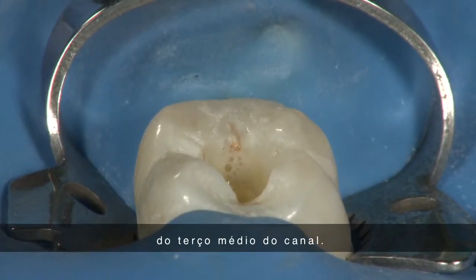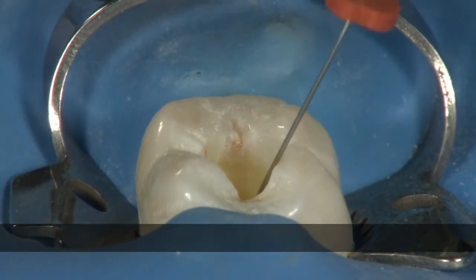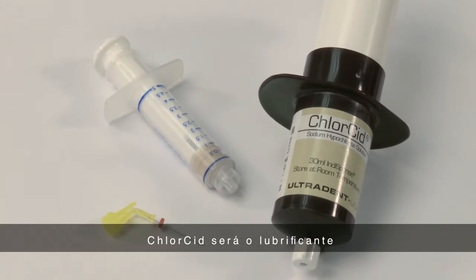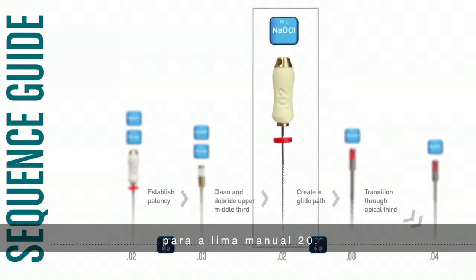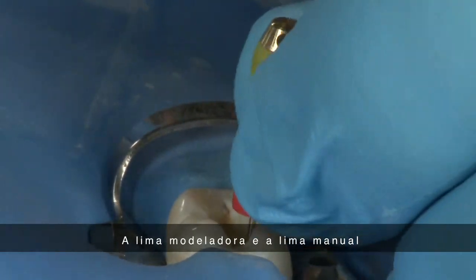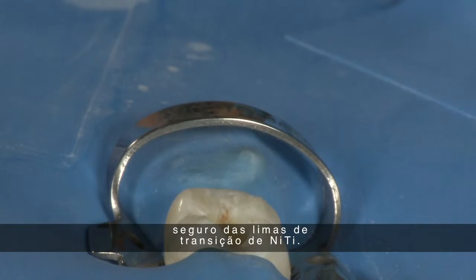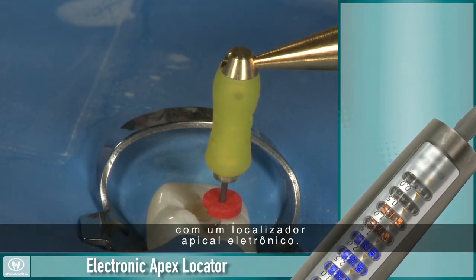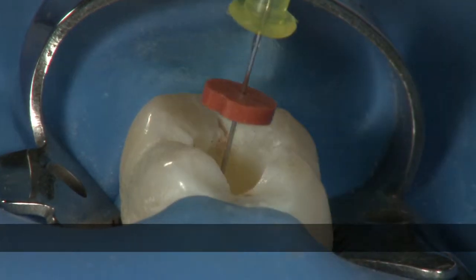Once you have finished instrumenting the middle third of the canal, evacuate the canal with a capillary tip and a lure vacuum adapter. Fill the canal with Chloracid once again. It is not necessary to use more FileEase, as Chloracid will provide enough lubrication to finish the procedure. Following the Sequence Guide, move from the No. 2 shaping file to the No. 20 hand file. Using the gentle watch-winding motion, take the No. 20 stainless steel hand file to working length. The shaping file and hand file are crucial steps for removing interferences in the middle third and creating a glide path for the safe use of the NiTi transitional files. Once the No. 20 hand file moves freely in the canal, reconfirm your working length with the electronic apex locator. Evacuate the canal and fill it with fresh Chloracid — constant exchange of irrigants will help remove dentinal mud and other debris.